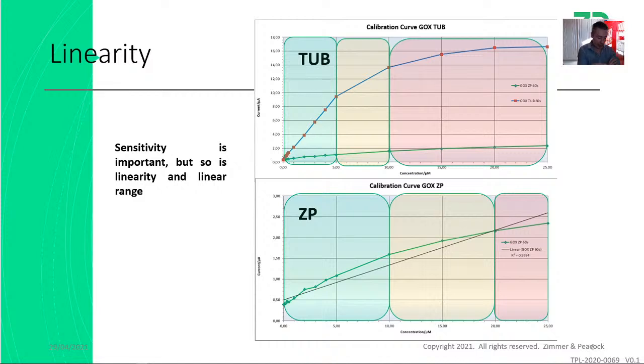So you have to look back at the slides earlier on. But one of the problems if you don't have a good linear range is because you've got either too much glucose arriving and therefore not enough enzyme activity, or in fact the real reaction that's going on here is glucose plus oxygen, and you become oxygen limited. So what do you have to do to fix this problem? You have to put in that barrier layer that I discussed earlier on. So you could potentially fix this formulation by actually putting in a barrier layer.